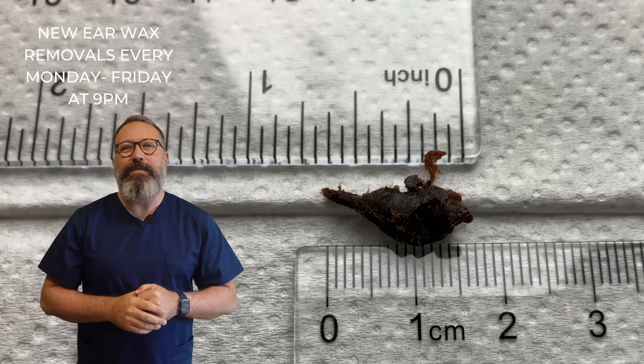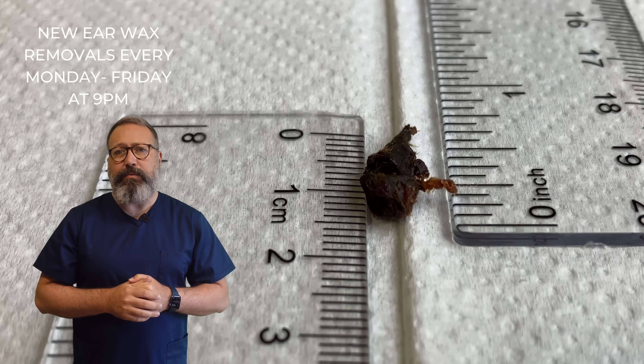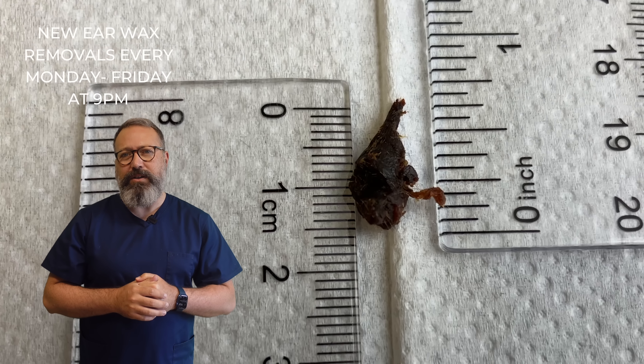So we can see the plug that we removed there — about a centimetre and a half, just under three quarters of an inch that one. And we've got it in a different shot there so you can just see the thickness of that plug as well.